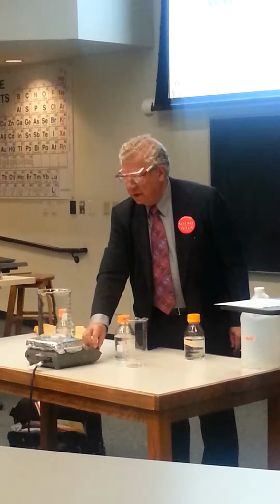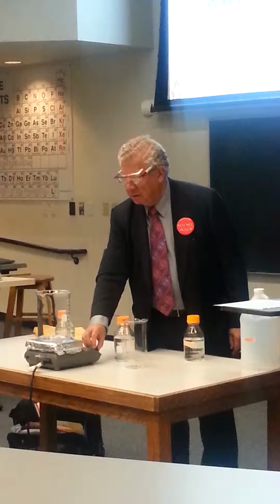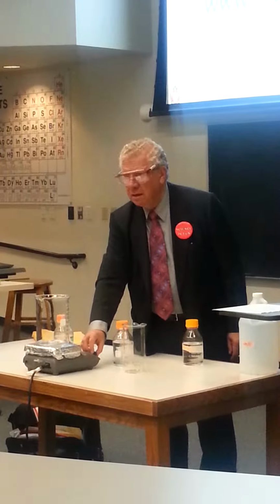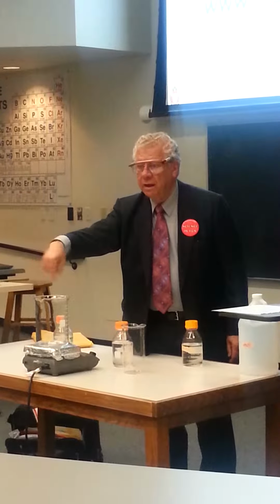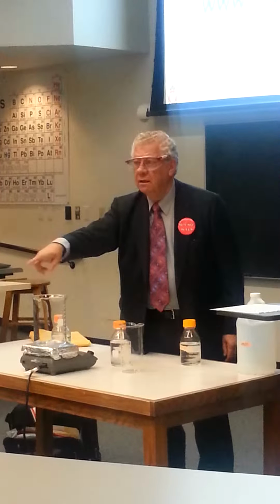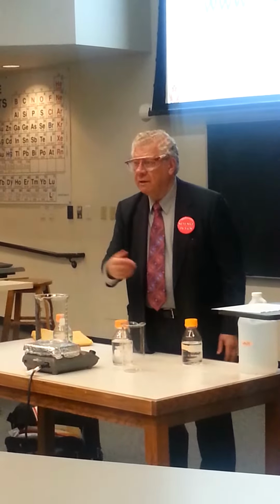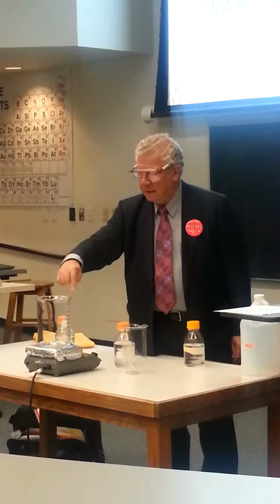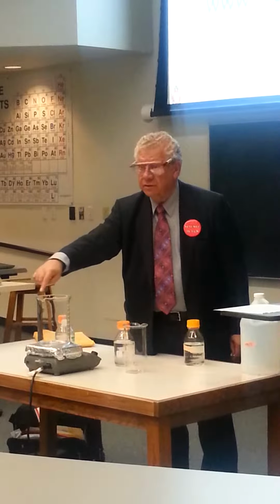And as we look down at the bar, is the bar spinning in a clockwise direction or counterclockwise direction? Can you see the bar spinning? It's going this way, right? Or this way? Different. Which way? Clockwise. You're getting me confused here, okay? So I look at it and it's moving in this direction, okay?